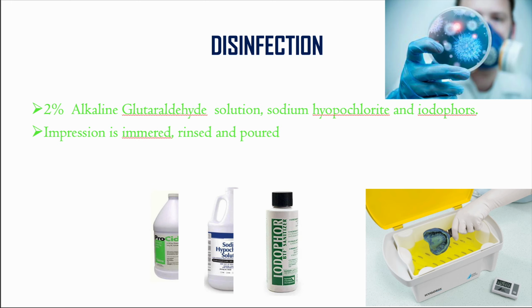Now coming to the disinfection of these inelastic impression materials, 2% alkaline glutaraldehyde solution, sodium hypochlorite and iodophors are commonly used for disinfection. For the impression, you can follow either the immersion technique or the spray technique. Since the material is hard enough, you can use the immersion technique. So it is immersed for almost 10 minutes in these disinfecting solutions. After that, it is taken out, rinsed thoroughly with water and poured.